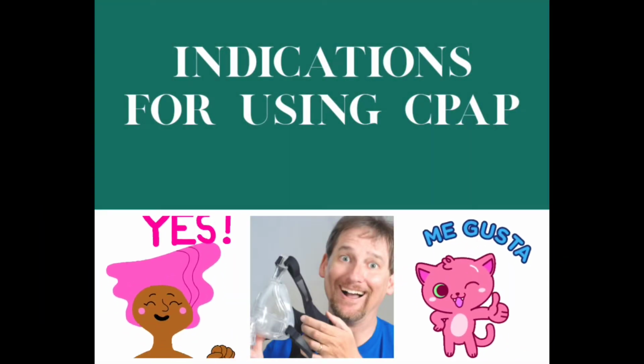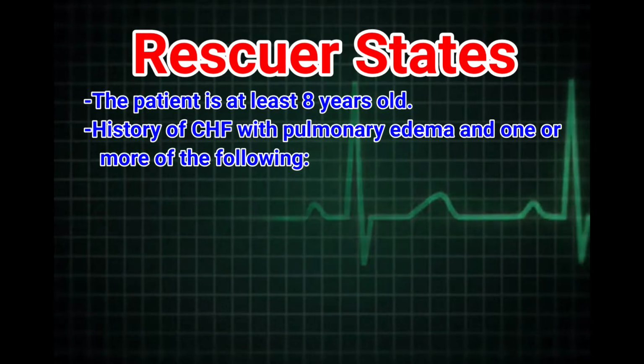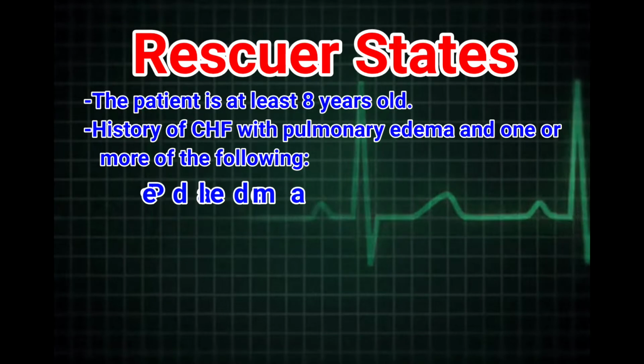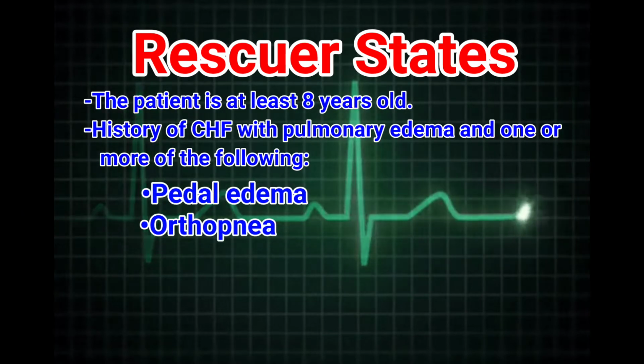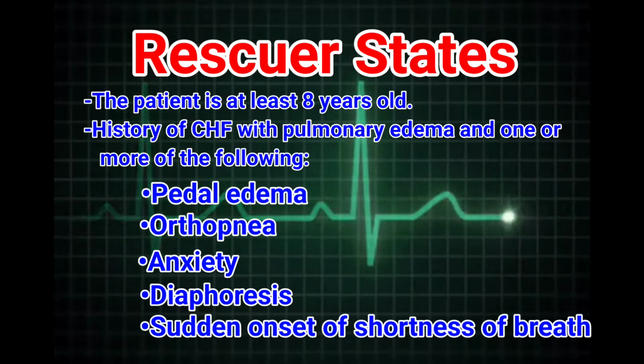Indications for using CPAP. Rescuer states, the patient is at least 8 years old, history of CHF with pulmonary edema, and one or more of the following: pedal edema, orthopnea, anxiety, diaphoresis, sudden onset of shortness of breath.